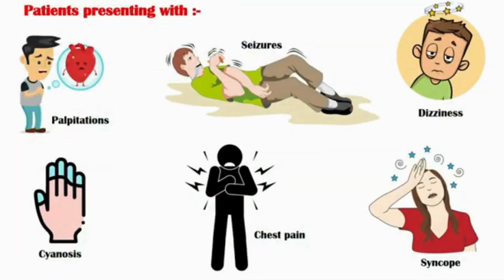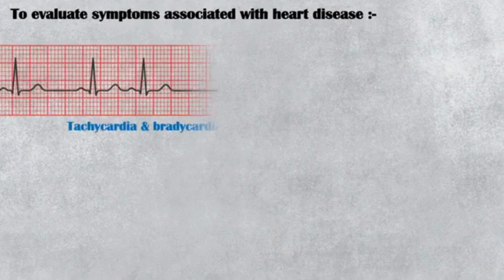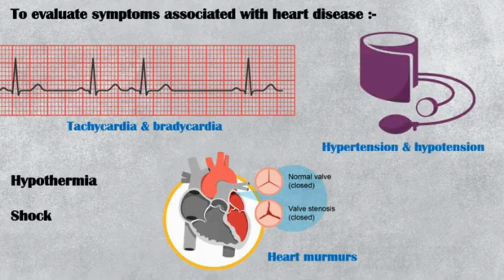In patients presenting with symptoms such as palpitations, dizziness, cyanosis, chest pain, syncope, and seizures. Symptoms or signs associated with heart disease, including tachycardia, bradycardia, hypothermia, murmurs, shock, hypotension, and hypertension. To detect recent and previous myocardial infarctions.